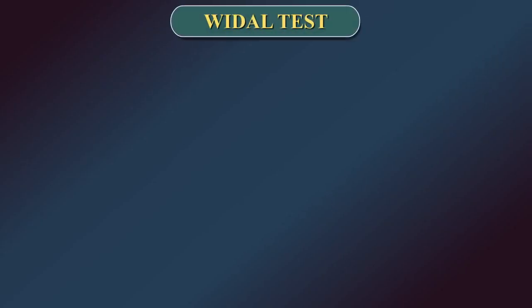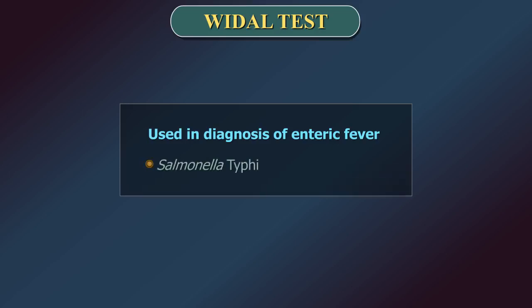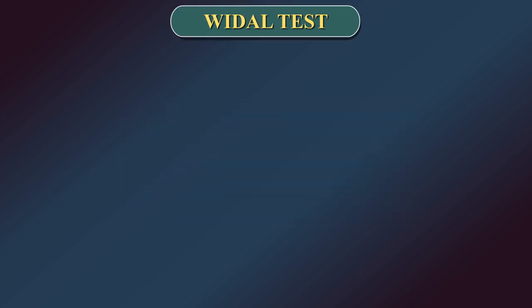Widal test. Widal test is used in the diagnosis of enteric fever, that is, typhoid and paratyphoid fever, caused by Salmonella typhi and Salmonella paratyphi A and B respectively.